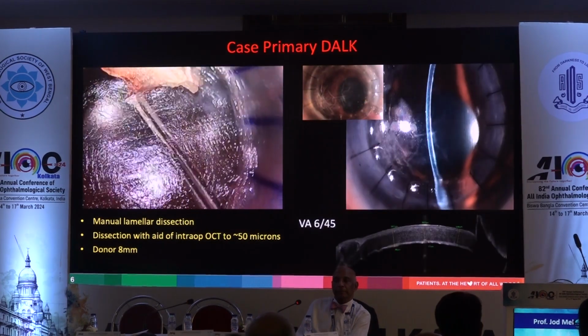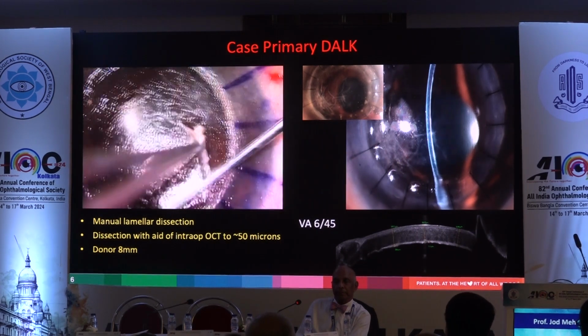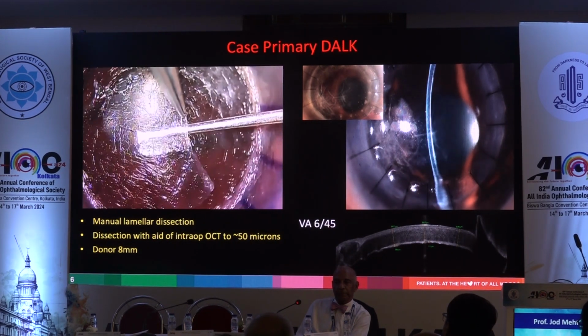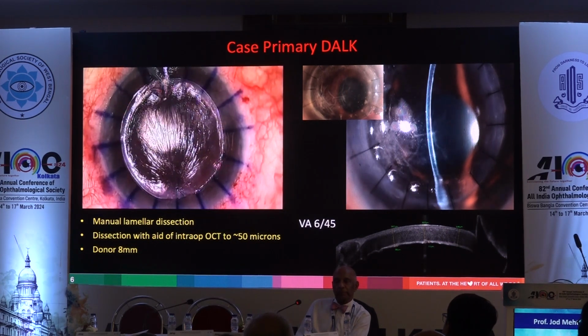If you look at this in a little more detail, you can see it on the slit lamp, and this is the post-operative ASOCT. Her vision improved from count fingers up to 6/45. You can see the folds now coming on the video as I'm getting closer with the dissection. You do have to be careful. You can easily rupture these folds when you're doing the surgery.